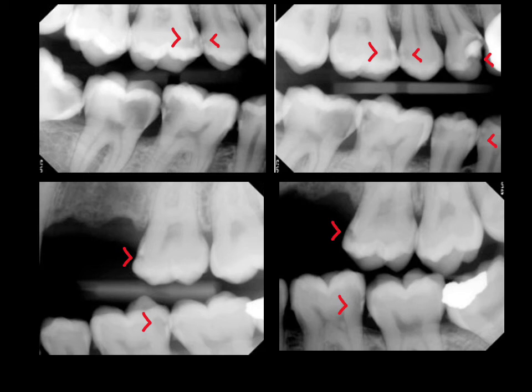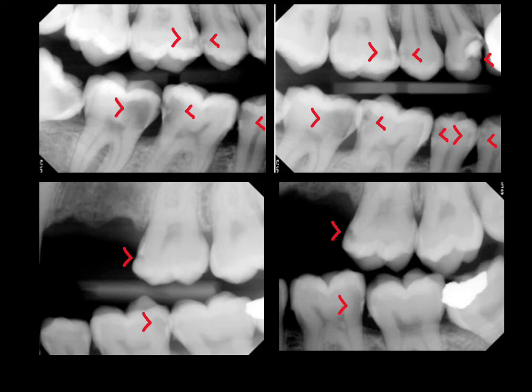Dropping down to the mandible, there's certainly significant decay on the distal of 19, which we can see on both radiographs. Continuing over to the right side of the mandible — distal of 28, mesial of 29, distal of 29, distal of 30, and then there's huge decay on the mesial of 31. On number 31 and number 32, I can't tell if there's a break in the interproximal area, so this could represent occlusal decay on the mesial aspect, which we would be able to confirm clinically.